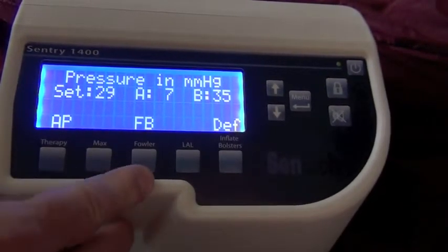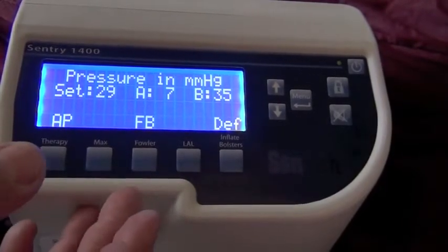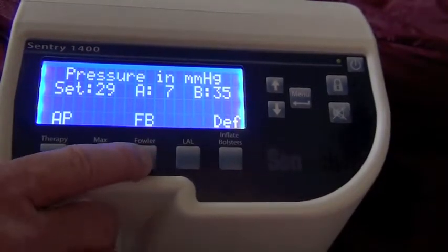So any of your patients who admit with reflux, who are on tube feedings, where you're concerned about aspiration, you want to engage Fowler Boost for those patients.